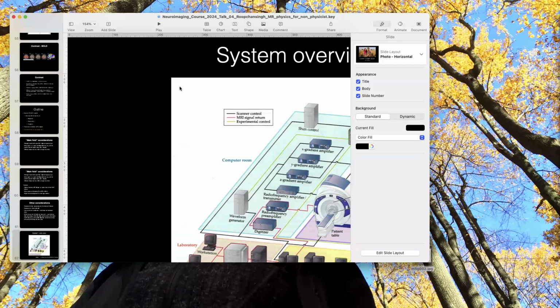And then you start becoming susceptible to things like thermal fluctuations and randomness at the very low level. I think maybe thermal noise is not the best term for that. It's kind of a catch-all, but system noise, basic limits of the hardware.